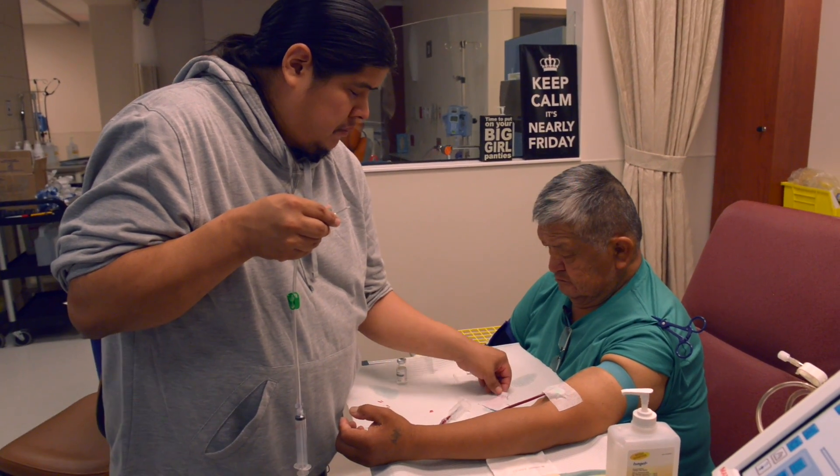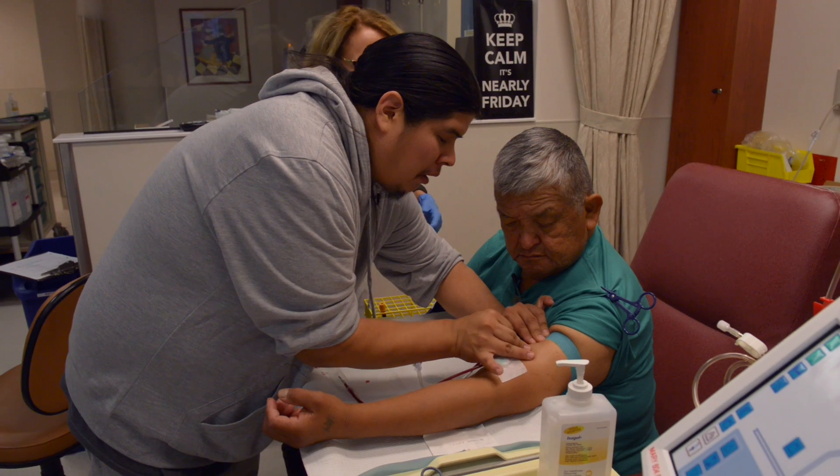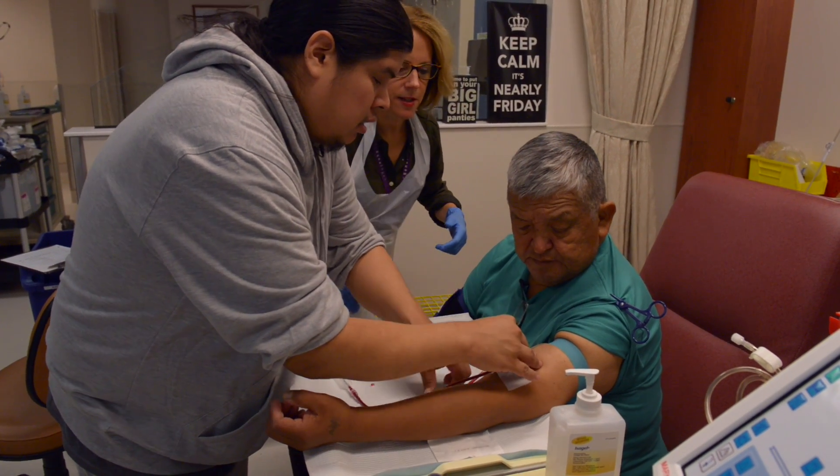I was unsure of myself and I didn't want to handle a needle yet. She came to it, picked up the needle, and handed it to me and said, 'Just do it.'